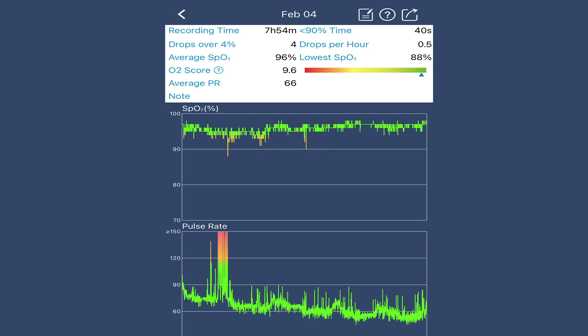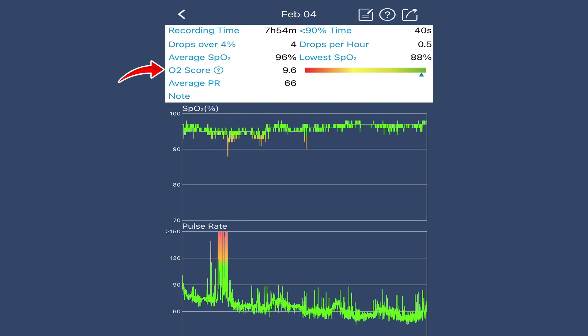I'll just run through some of these other stats because they're quite interesting. And then after this, I'll actually show you someone else's results so you can see the difference between someone who's got reasonably good breathing and someone who's struggling a bit and probably needs to investigate a bit further. Starting on the top left, we've got the recording time. So that's how long I had the device on for, close to eight hours. Now, I wasn't asleep for those eight hours because I've got a brand new baby, but that's how long I had the ring on for. Drops over 4%, so only four times it dropped over 4%, which is fine. My average was 96%. So that's all the oxygen levels throughout the night averaged out equals 96%. Nice and high.